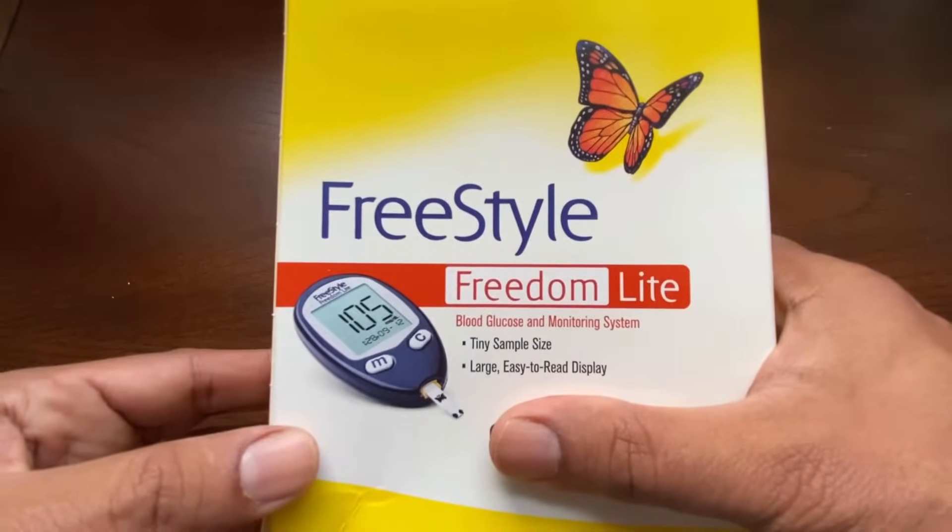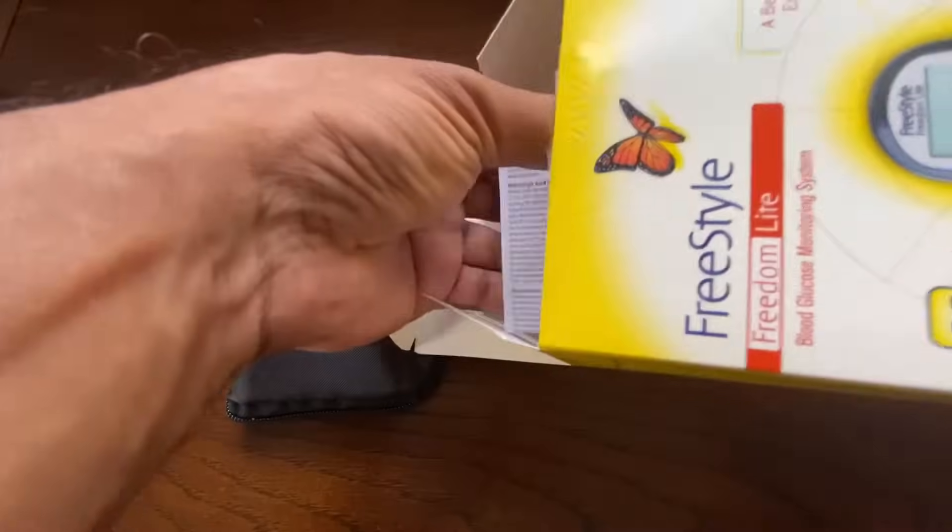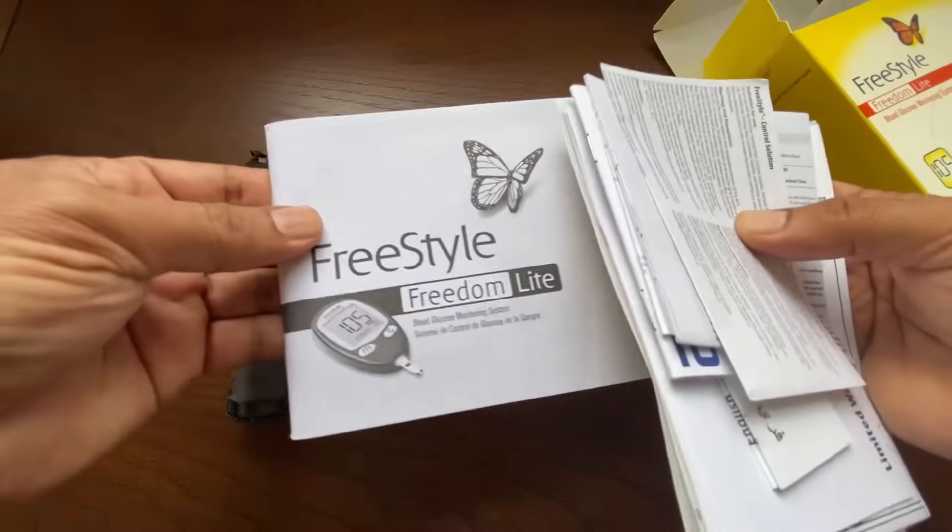This video shows the steps to use the Freestyle Freedom Light Blood Glucose Meter. The kit comes with a carrying case, quick start guide, and owner's booklet.